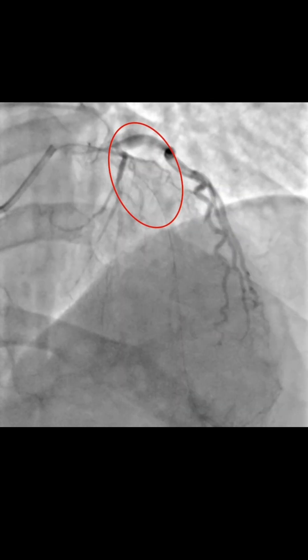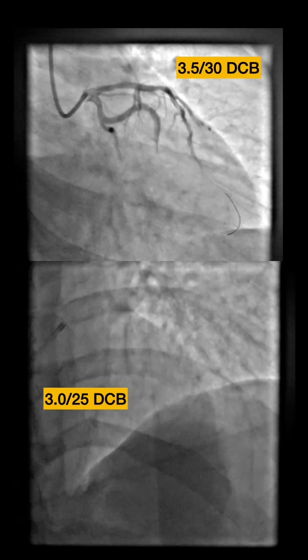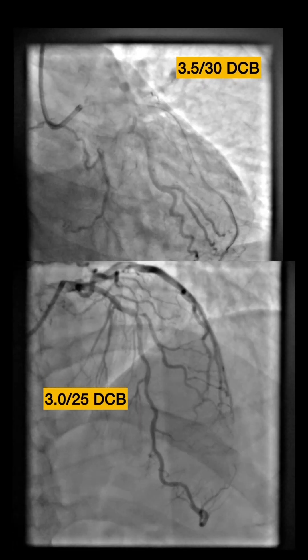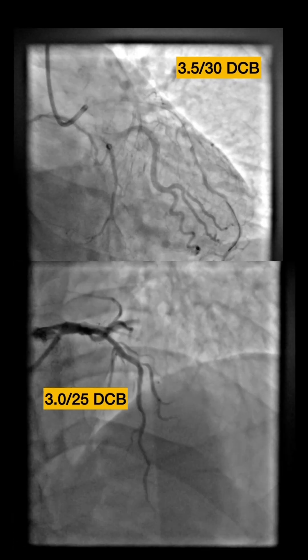We went ahead with our drug-coated balloon strategy. We used a 3.5 DCB for the proximal LAD and a 3.0 DCB for the mid-LAD. The final result shows no flow-limiting dissection and no significant residual narrowing.